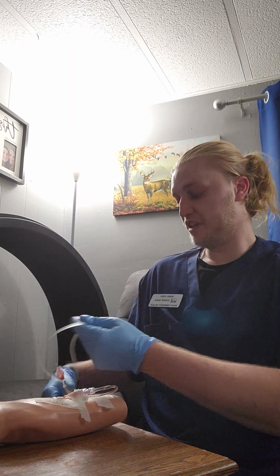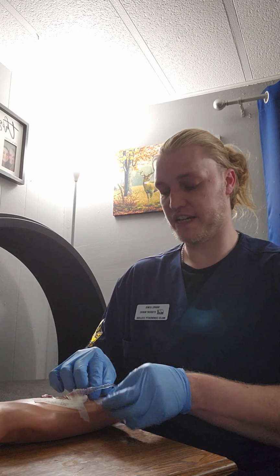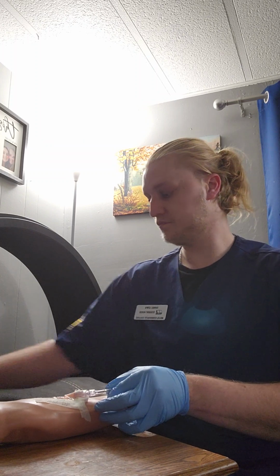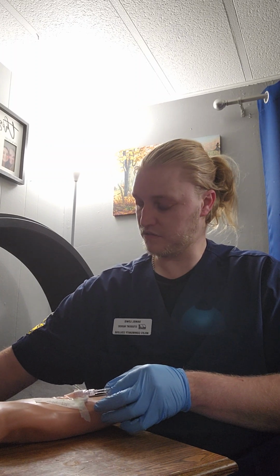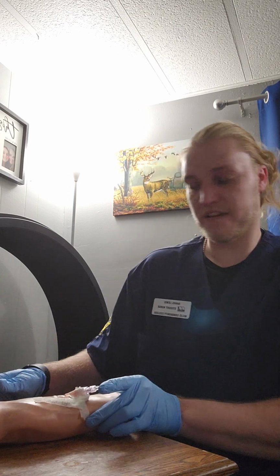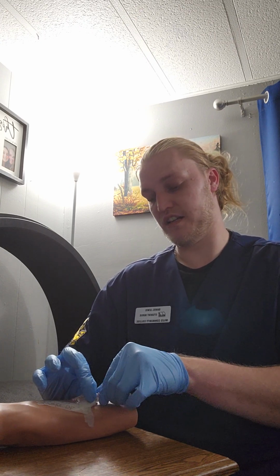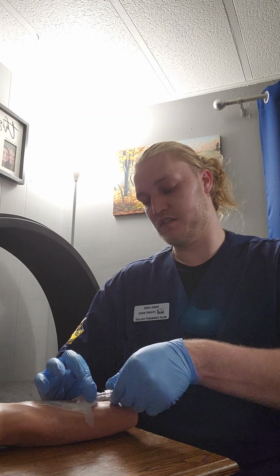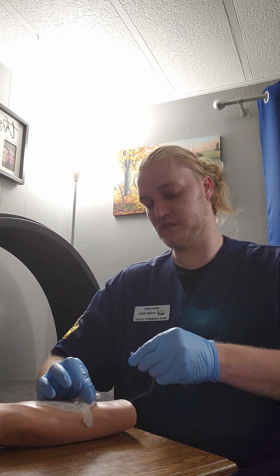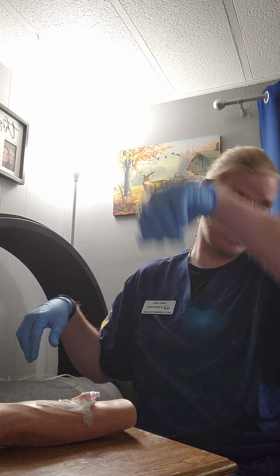Okay, so the tubing is already clamped. At this time, I'm going to remove the tape that is holding the IV tubing down. Oh, the tape is stuck to my gloves. Come on, get off me. Okay, I'm going to secure this, and I'm going to remove the tubing. And I would just hang that up or flip it on the pole.